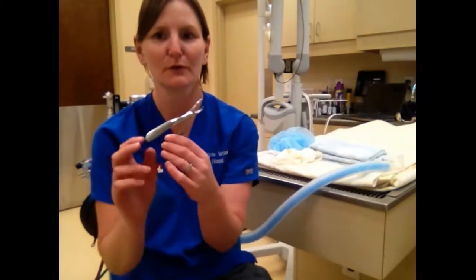This is task 50, dental. So I just wanted to go through some of the instruments we'll be using today and the things that we need to have on hand when we perform a dental. I'm going to start with the calculus removal forceps.